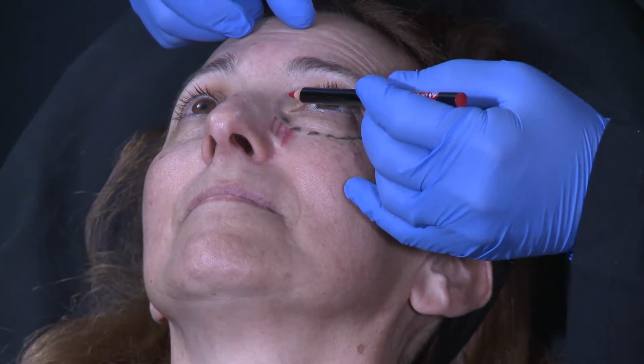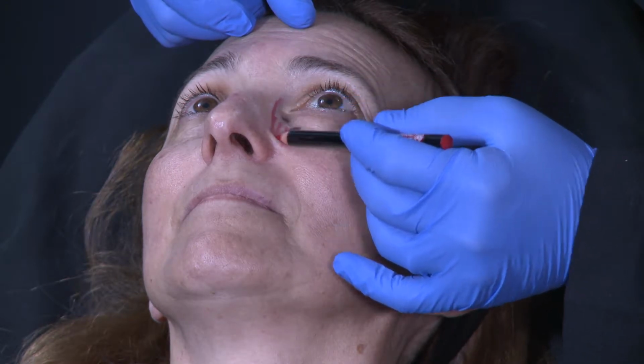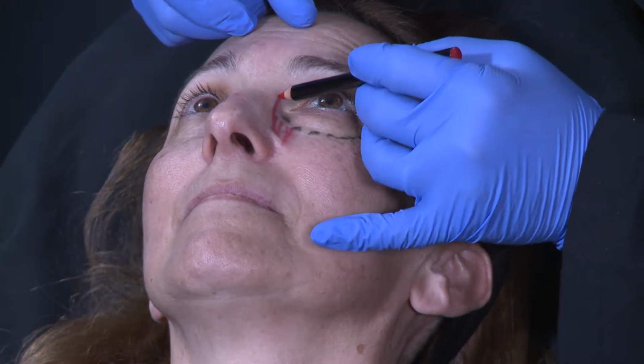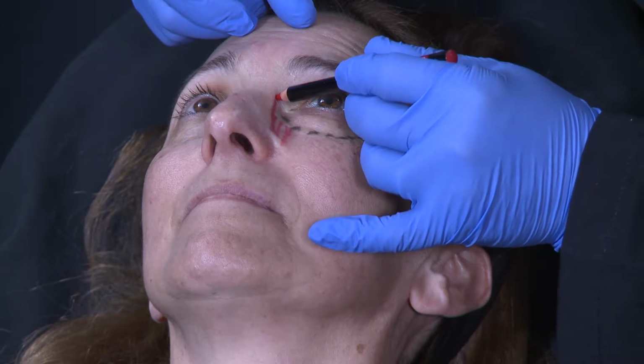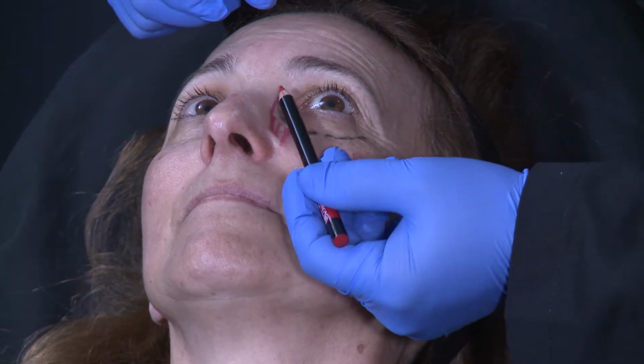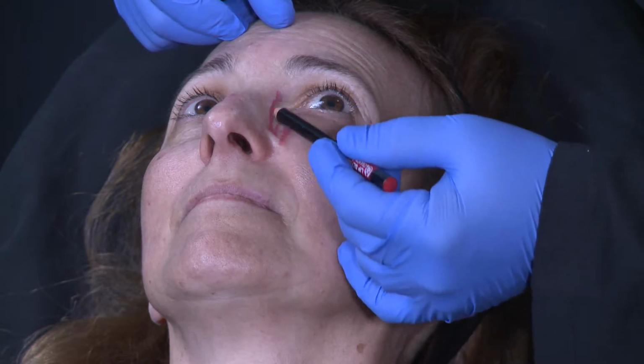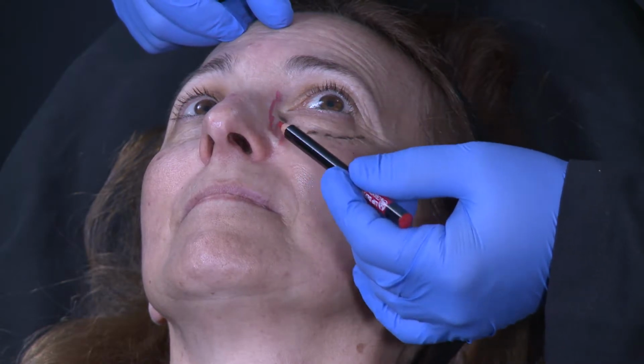So this artery is going up here, above the muscle, and then here perforates a muscle called the depressor supercilii, just after to be deep in the glabellar area. So this artery is well identified here.